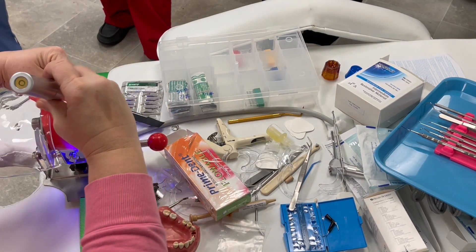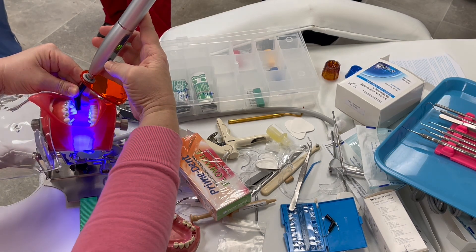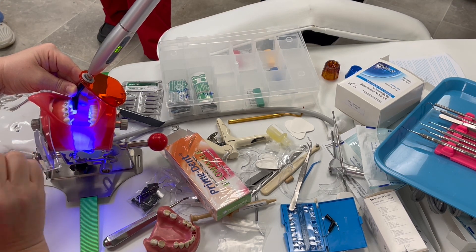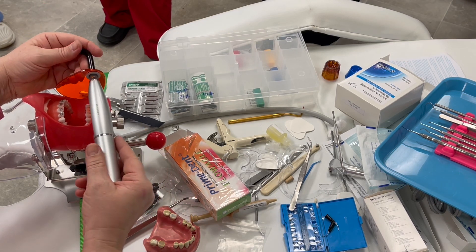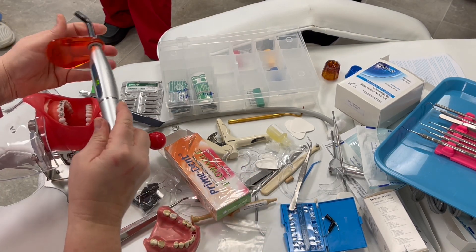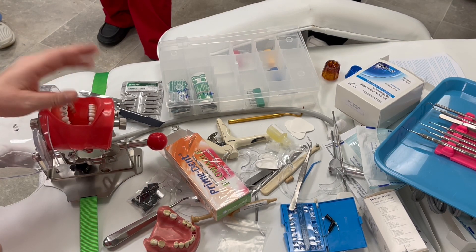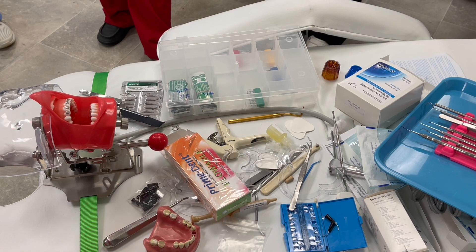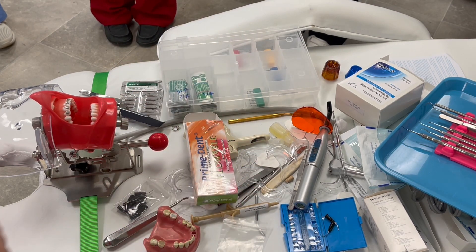Once you're done, you hit it with the curing light. These lights come in different settings — you can have a solid blue or an intermittent light. You have to light it for 30 seconds. There are some very intense lights, just like a tanning bed. Know what you're using in your office, because if you hold this light down too long it could heat up the composite and the patient would feel a burning sensation. Check the package to know your curing time.